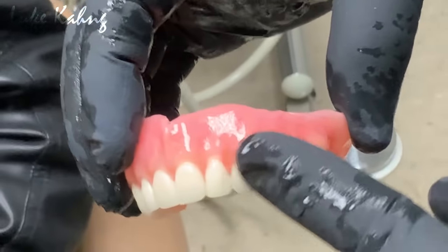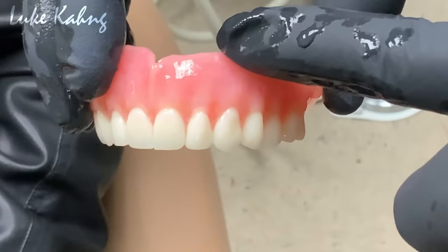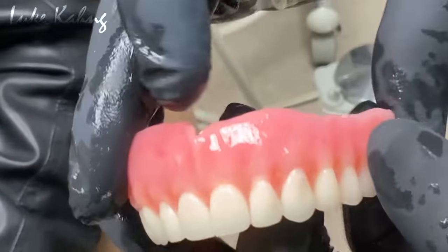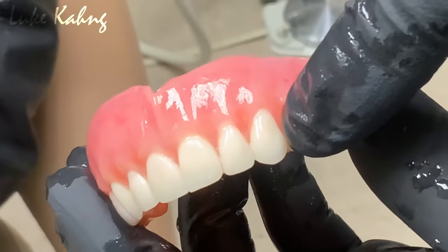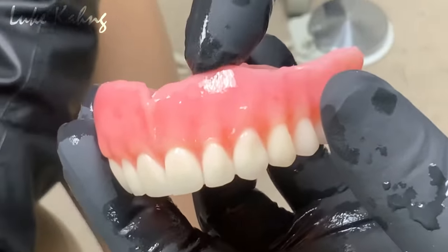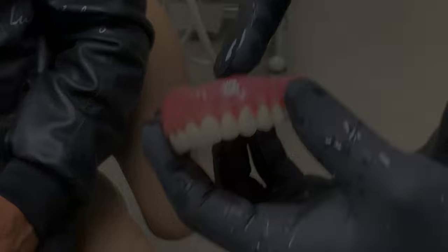Okay. When they're doing this, I tell them to point to the tooth in reference. So they'll put their finger all the way up here and say, I feel down here, and then we go down to the tooth. And I know he just pointed at his canine. So up on the canine, you see this little ridge right here, and that's actually coming in a little high, still in the sulcus. So make a quick adjustment, okay?